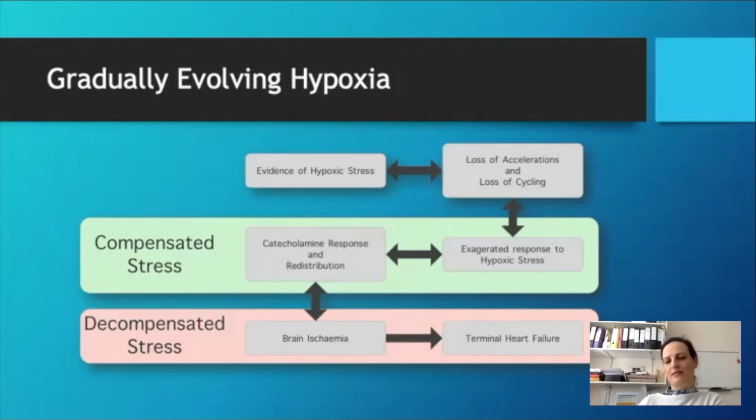In the same way, you wouldn't respond the same to a person's tachycardia. Is it because they just ran down the corridor to attend a shoulder dystocia, or because they have COVID, or a tachyarrhythmia, or because their normal heart rate is already on the high side? All these tools are to make us think, not to make us brain dead, please. I know you all think.